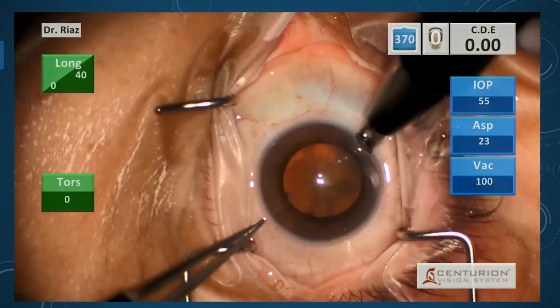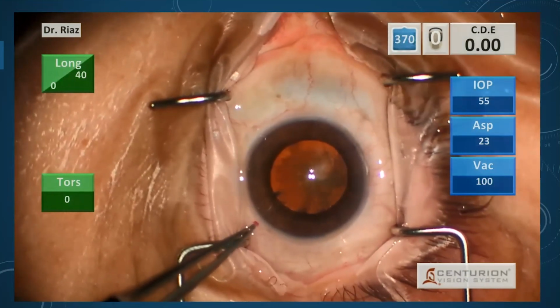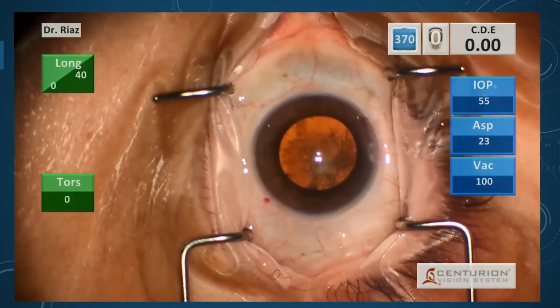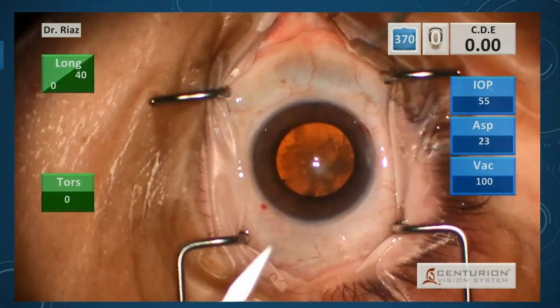It's really important to almost twirl the finger. That's why I usually tell our trainees, imagine you're twirling, and then giving a little bit of heme like that is okay. It means you're exactly at the limbus, and then that's it, and you're ready to proceed with surgery. So that whole thing took maybe a minute, maybe even less than that.